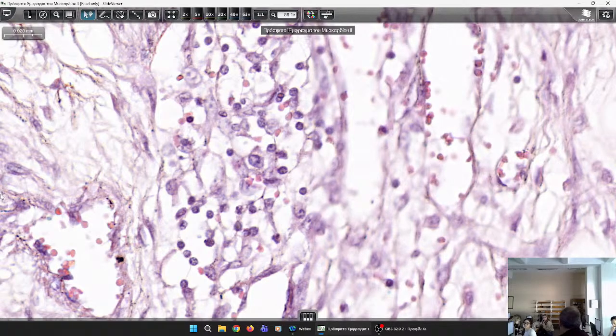So the cause of death here is most probably not a rupture of the heart wall, but a fatal arrhythmia, because especially in the area on the border of the necrotic tissue, this is called penumbra. This area is responsible for all these disorders in the heart rhythm and causes arrhythmias, which sometimes may be fatal for the patient.